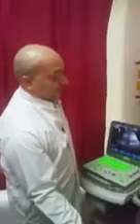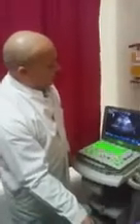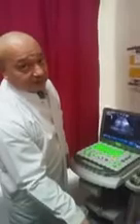In 90% of the unstable patients, I can see the free fluid just by looking at the hepatorenal portion, between liver and kidney, 90% of the time. You can elevate your patient's legs to 45 degrees, and this increases your sensitivity.